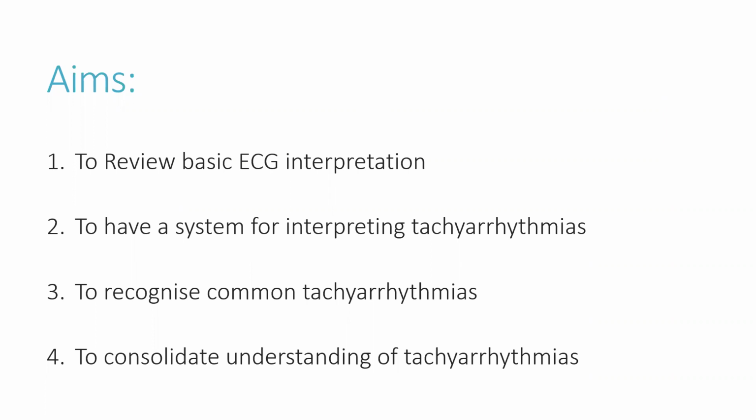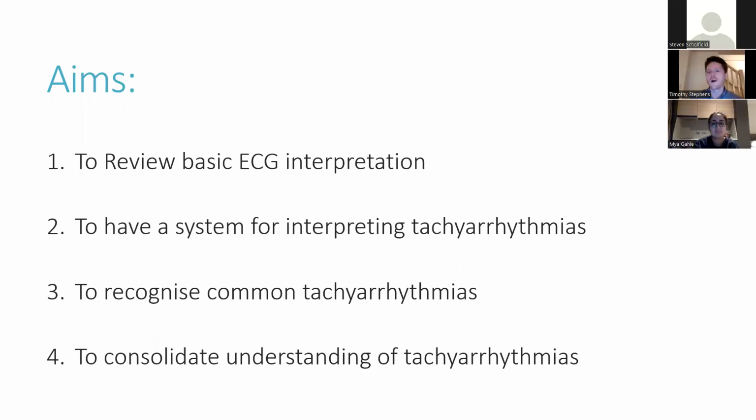Excellent, brilliant. So what we're going to try and do is go over basic ECG interpretation. It's obviously the starting point here to make sure you know a process of reviewing an ECG, have a system for interpreting some tachyarrhythmias, which is what we're going to go through, and to try and recognize some of the common ones as well. We're not really going to be able to cover all of them in this session, particularly as I'm hoping we're going to get you guys to just have a go yourself, but we'll try and look at some key ones here and also try and get a bit more understanding about the pathophysiology and management. But really, I want you to recognize that's the aim of this session.